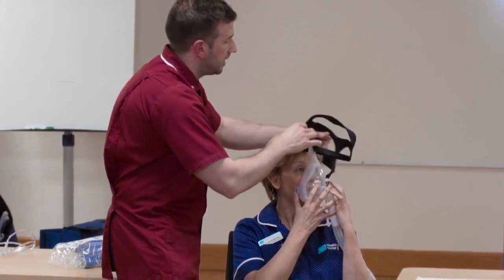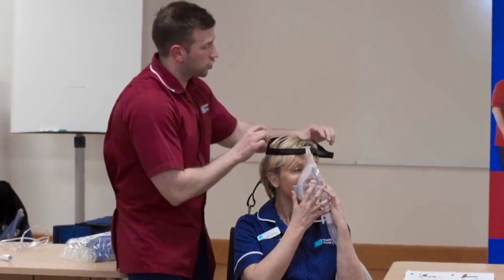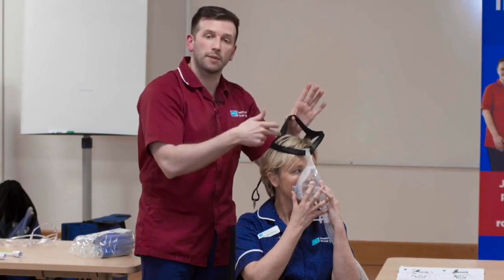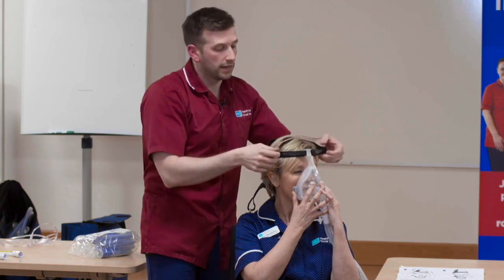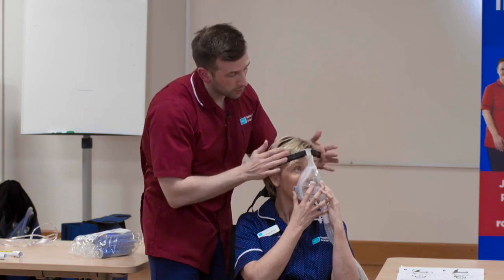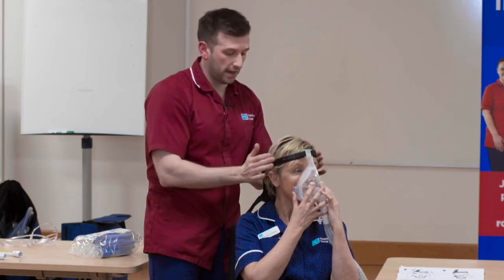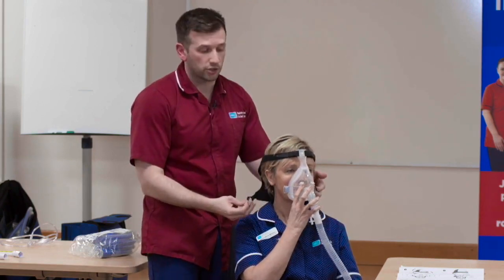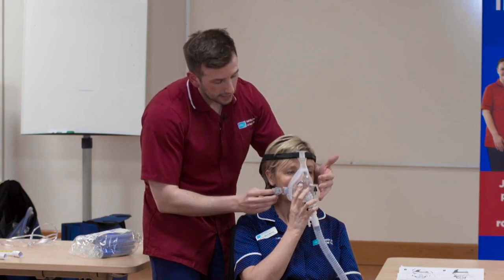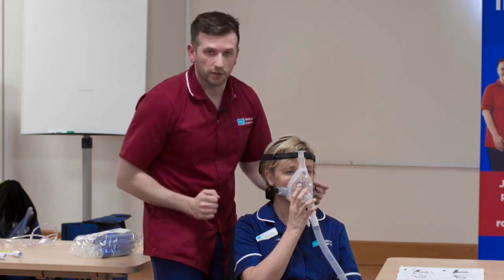And as you can see, the headgear has got a strap at the top called the halo strap, designed to sit over the top of the head to give support. You're going to have 2 support straps here at the top of the head, and you're going to have straps here designed to sit below the ears. What I will do first is I will connect the buckle.